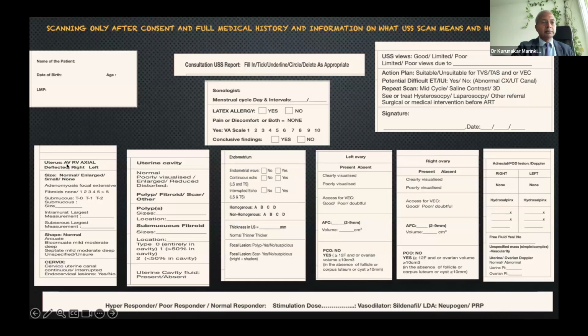So in the axis, if the uterus is dextro-rotated or levo-rotated, you cannot see the cervicouterine canal as soon as you put the probe in the vagina in the center, as soon as you go to scan. That should hint that you need to rotate the probe to correct the dextro-rotation, levo-rotation. You need to assess the cervix first in one particular axis and turn to another axis to see the endometrial outline, because there is right or left flexion of the uterus. So rotation, dextro-rotation, levo-rotation needs correction. Lateral flexion, right or left, needs particular adjustment of the probe to see the cervicouterine canal and the endometrial axis independently. If they are in the center, you can see.